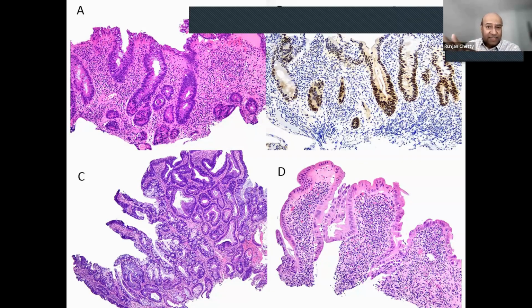And a disclaimer here, these are images from that review that I shared with you by Kirsten and company. But again, you can see clearly that this looks like an adenoma. Here it's goblet cell rich, it's a bit villous. And again, even here, you will see that there's dysplastic change. Here it's a little bit more subtle. The epithelium is more eosinophilic.